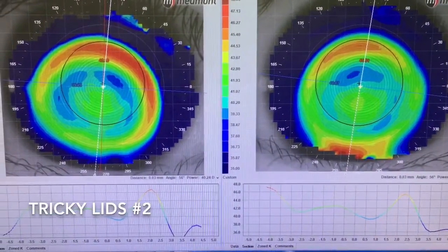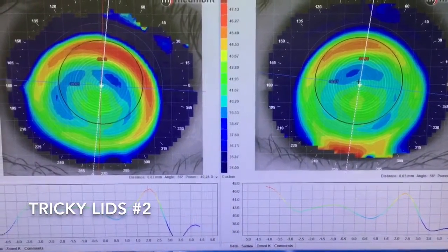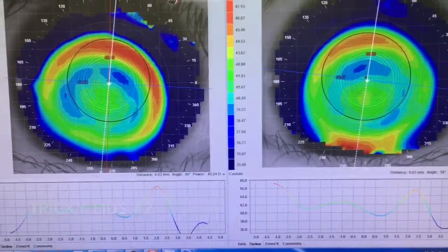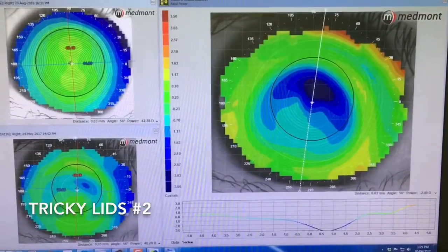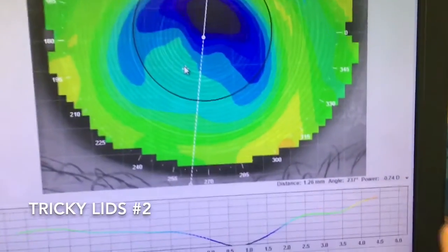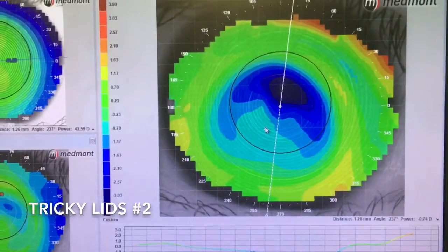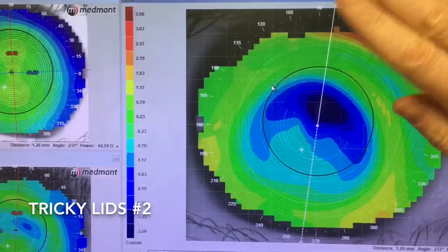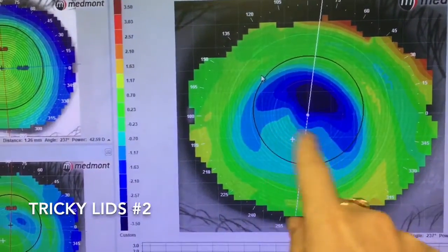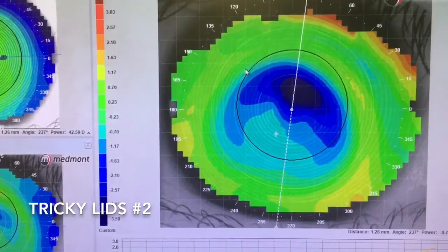This is another ortho-K case where we've just not been able to get where we need because of Asian lids. Looking at the tangential plots first, it looks like a central island — like we're simply not getting enough treatment in the central area — but if I change to an axial map and then a difference map, you can see there's quite a bit of treatment. That area that looked like a central island actually does have proper flattening. We just can't get full treatment because the top eyelid shoves the top of the lens down, it flicks up at the bottom, and we don't get enough treatment down here — the lens just doesn't seal down through 360 degrees.